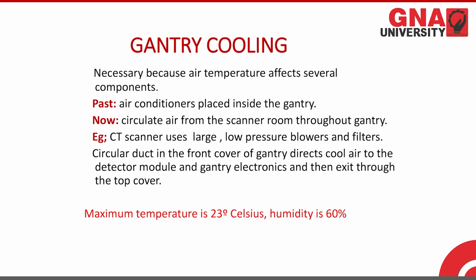Now, the gantry contains multiple electronic devices which have to work continuously for a long period of time. Along with that, we have the X-ray tube, which produces a much higher exposure than the diagnostic X-ray. So, gantry cooling is required. In the past, an air conditioner was placed in the gantry, but now we go for the rotating anode X-ray tube, so we need to circulate the air from the scanner throughout the gantry.